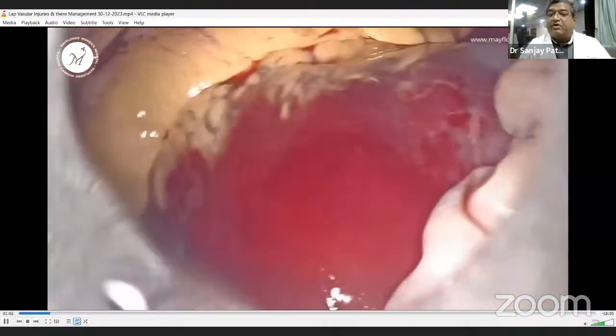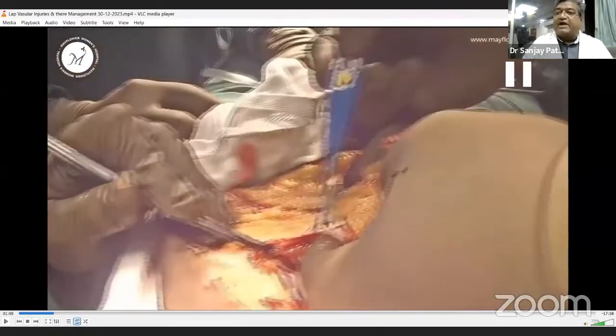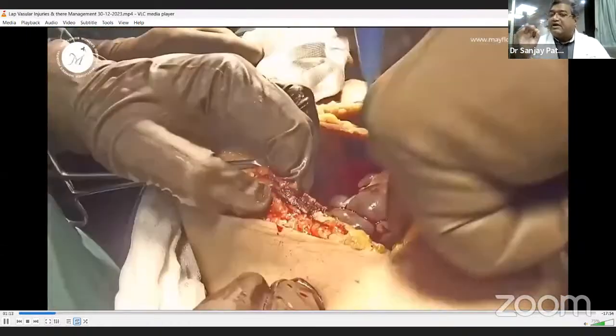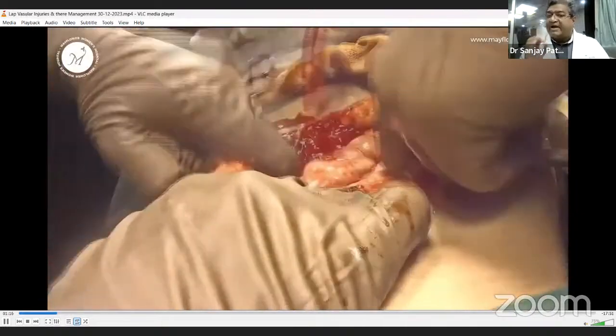Then we look here. This is a huge hematoma above the level of symphysis pubis, and it's also extended. Without wasting time, the most important part, then you realize, even though you dissect the aorta during para-aortic dissections, and if you injure the vena cava or aorta, the story related to suturing and managing this vascular injury is easy. But a true cut diamond trocar injury really creates a big problem, because it's really challenging to manage.